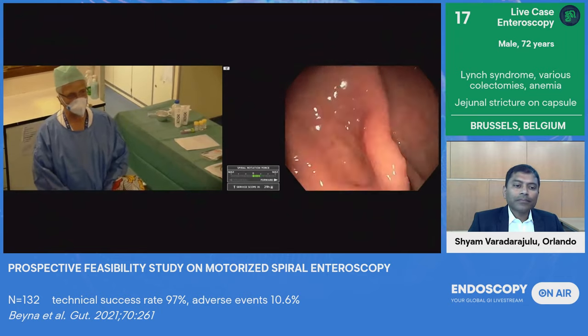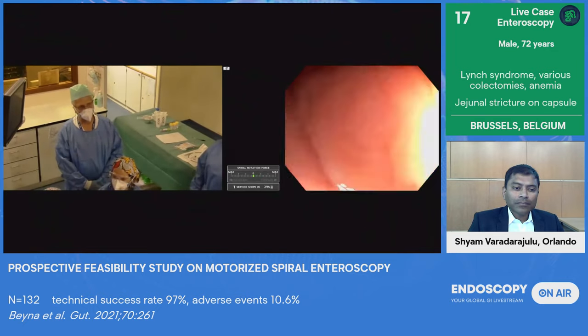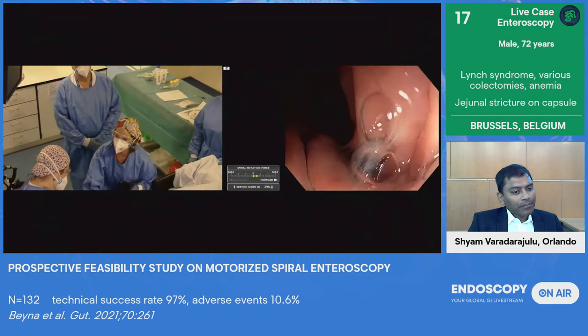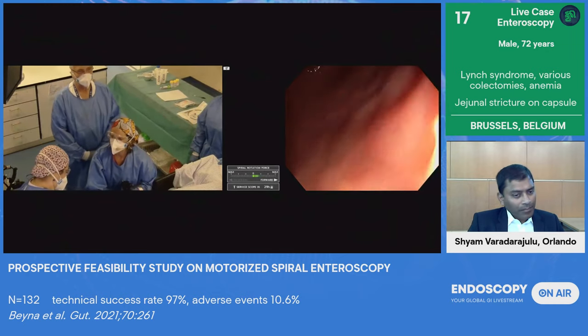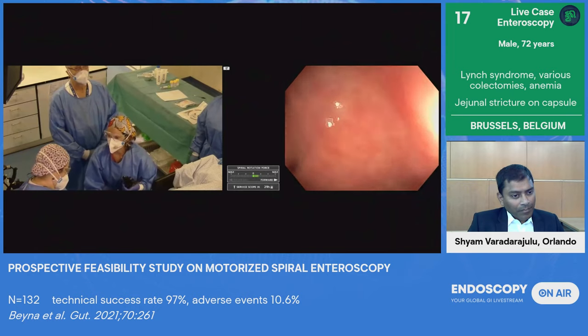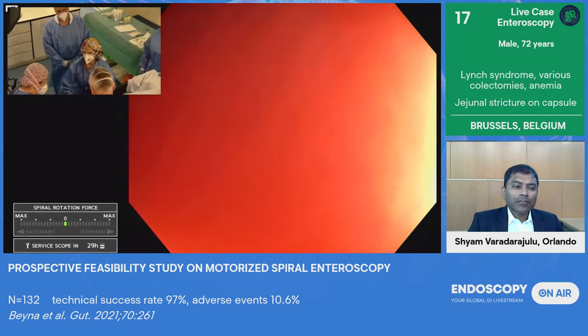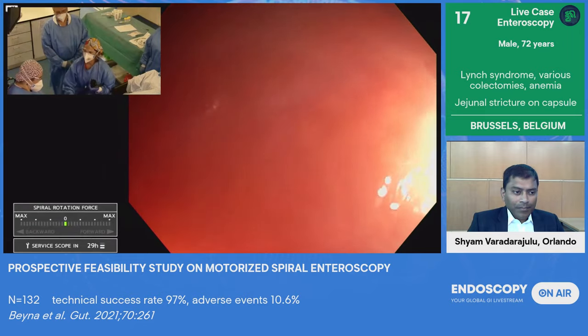Later on, you will see that the technique consists in pleating the small bowel over the spiral. And so here we see that we always have a vision on the resistances. This is important when we're in the esophagus, because when we have resistance, we will stop, we will do some backwards, then go forwards again. And we have a marking at 80 centimeters, which tells us that all the spiral is inside the stomach. So here I ask Michel to re-inflate. And here we are in the stomach.